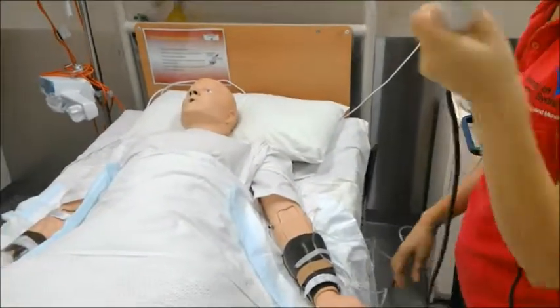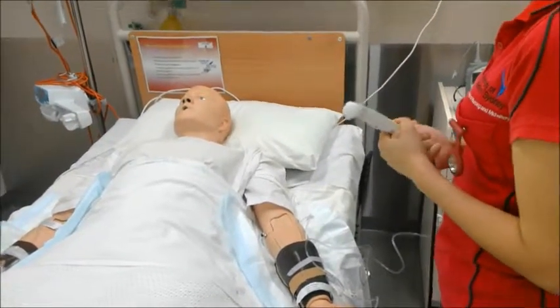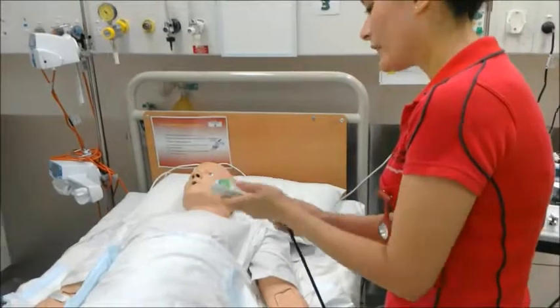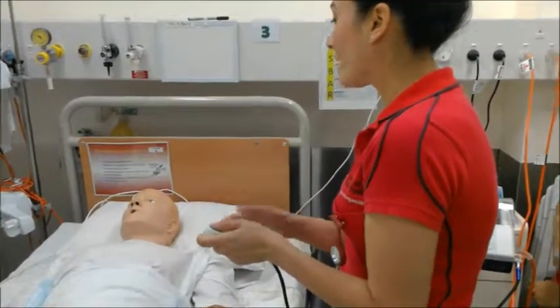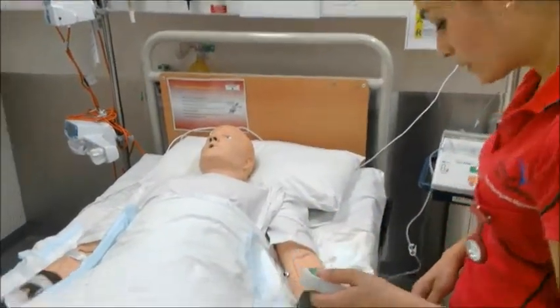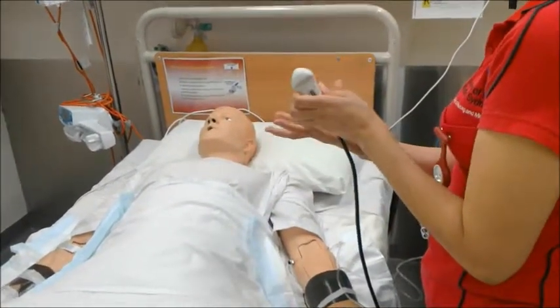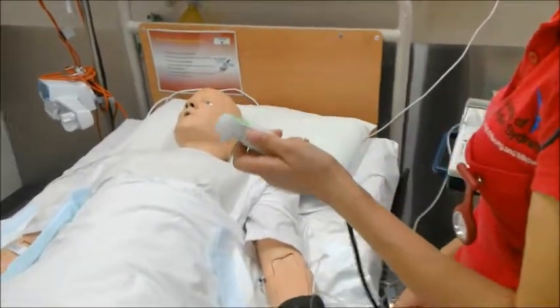Okay, Mrs. Adib, I have connected this PCA line to you now. You can have it whenever you are in pain, but you have to press this green button. This is the PCA green button. You have to press it whenever you are in pain. Once you press it, you will get another dose only after 5 minutes. I was just wondering if you could press this one for me. Whenever you press it, you'll hear the beep noise and the light will click, so you will know you are getting this morphine or pain relief medication.